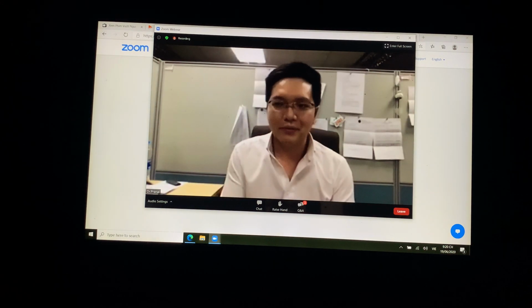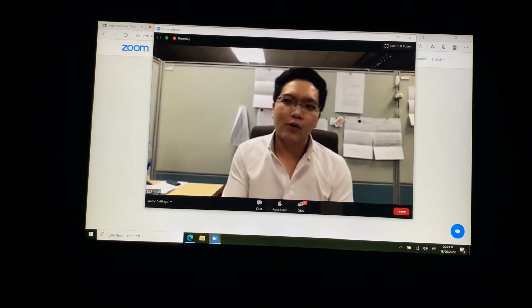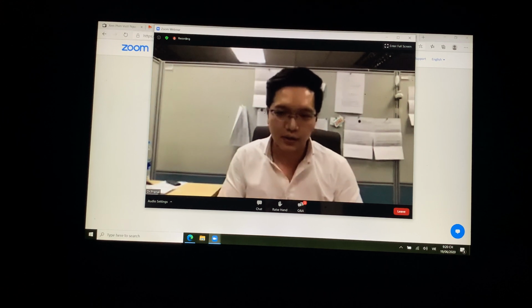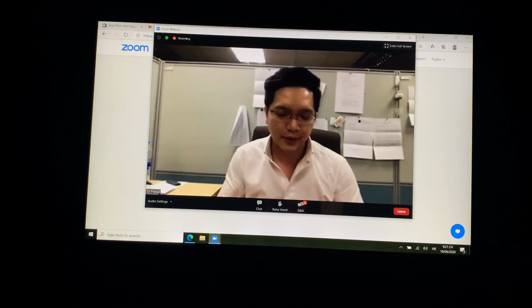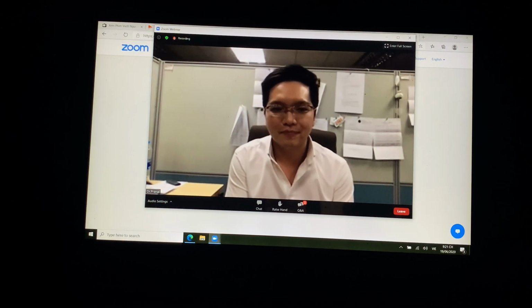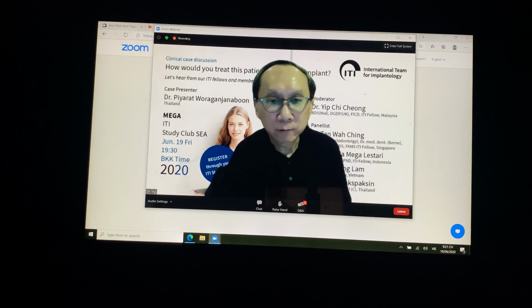That's a very good question. Normally, I only wait 3 to 4 months after the surgery to move on to the final stage. However, with this patient, we actually have to put veneers on the number 1-1. So we try to recontour the soft tissue by putting composite fillings there first to reshape the soft tissue before we move on. We were planning to wait an additional month for the soft tissue to be in shape before doing the impression. However, because of the COVID situation, right now it's 8 months. So on average, it's about 3 to 4 months, and then you finish with the final restoration.